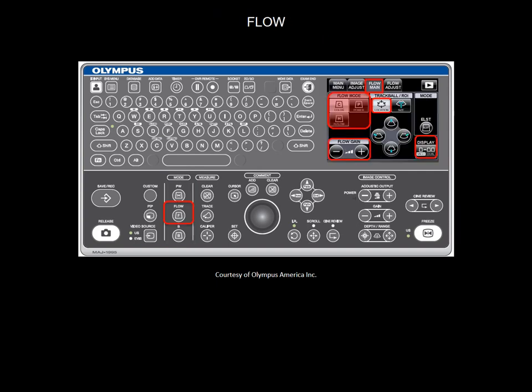Pushing the flow button will change the touch panel display. You will be able to choose from the three flow modes, locate the region of interest or ROI, and adjust the sensitivity of the flow signal by using the flow gain buttons.